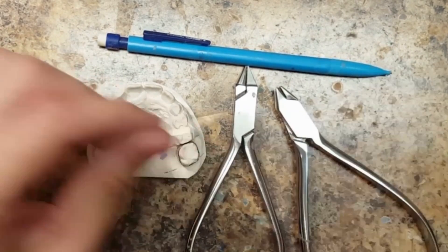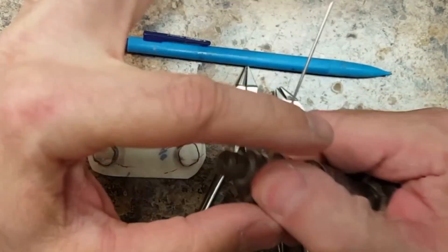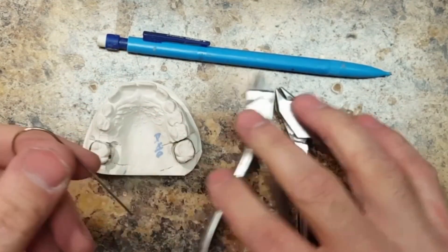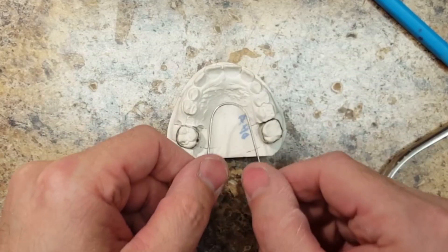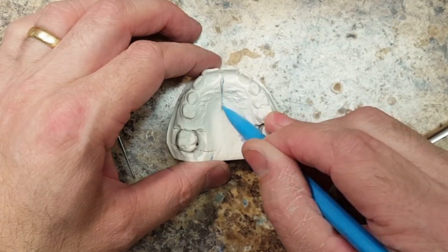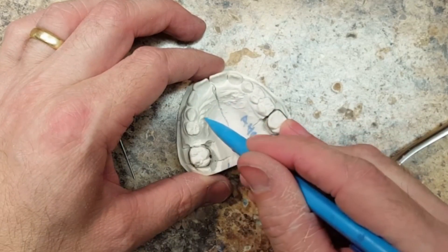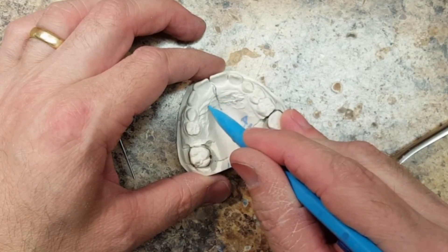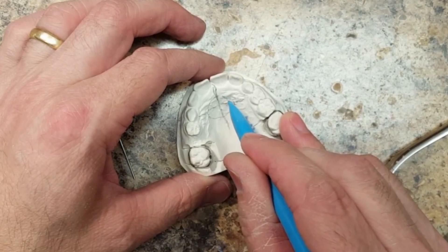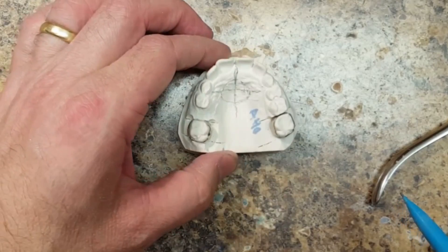I take an 040 piece of wire and I'll use my orthodontic turret to create the initial loop. The key to this appliance is to keep that wire approximately one millimeter off of the tissue. I also draw a line on there to show you where I'm going to put my Nance button — this gives you a reference point to make it nice and even when you finish the appliance.